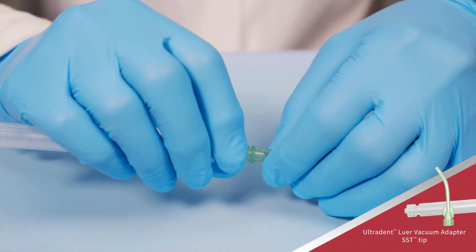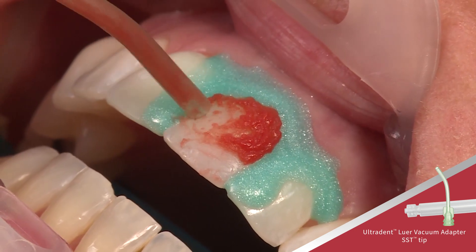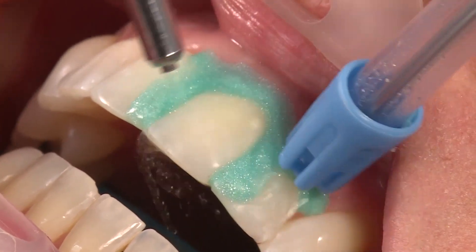Suction gel from teeth using the Luervac adapter and surgical suction tip. Do not use water while suctioning gel. Clear suction periodically with water. Then thoroughly rinse teeth with an air water spray.